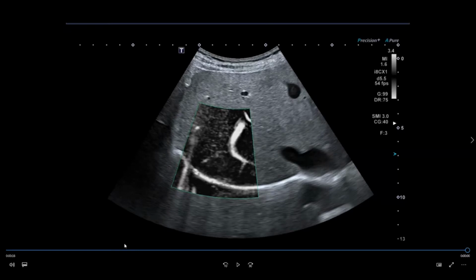So in my usage, I use this to be more confident, and in this case I just follow up the patient with ultrasound first. I do not need to hurry to MRI. And the other one is FNH, which has a spoke wheel pattern. We have to correlate with the patient's risk factors as well. If you have a spoke wheel pattern and a young female, in this setting I think it's quite good for FNH and it can be followed up. In the other setting, if you have a high risk for HCC, I think imaging is still needed, like MRI or CT.